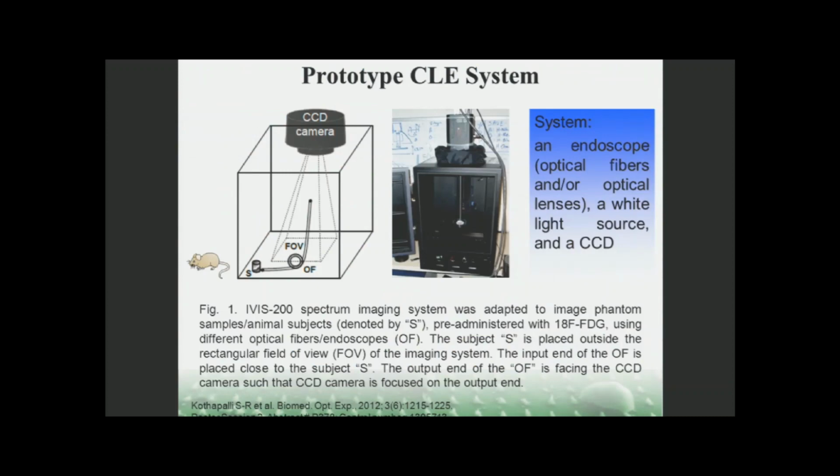Here we just developed the first prototype Cerenkov Luminescence Endoscopy (CLE) system. You can also find the abstract and poster presentation for this work. If you are interested, you can talk to the first author of this work, Raj. The abstract is P378, and he is here, so you can meet with him and discuss this work in more detail.